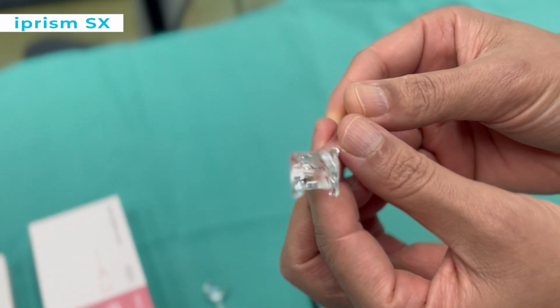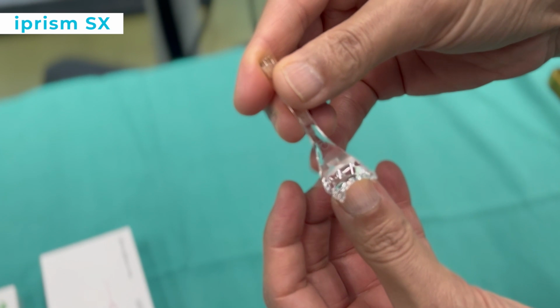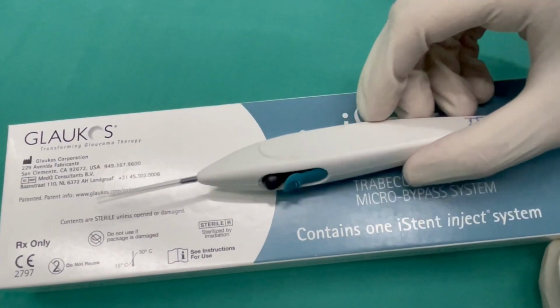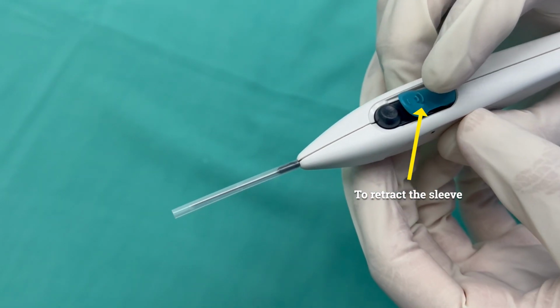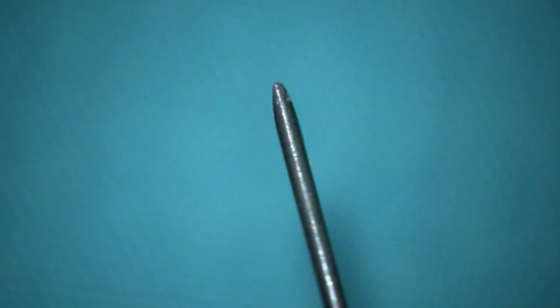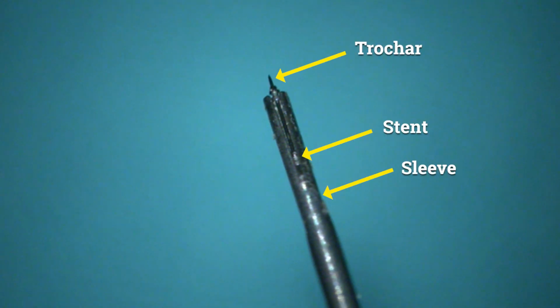This is the eye prism SX that has a self-retaining surface so that minimal support is required for holding. The eye stent injector looks like a pen with a long tip. It has a blue button to retract the sleeve and a black button to implant the device in the Schlemm's canal. Here, under high magnification, we can see the tip of the trocar that is exposed after retracting the sleeve. The stents are seen in the injector.